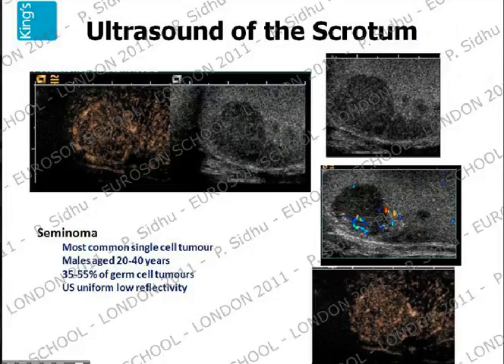And in our experience, we find that the vascularity comes in very rapidly and goes out just as rapidly. So you've only got a period of about 30 or 40 seconds to look at the vascularity of these tumors, but it does pick up these areas of irregularity and problems with the morphology.